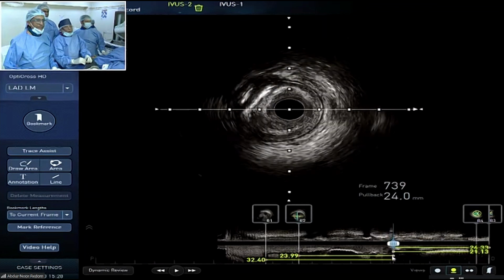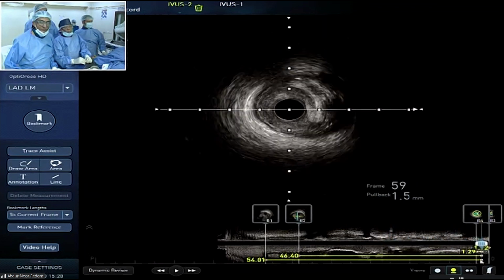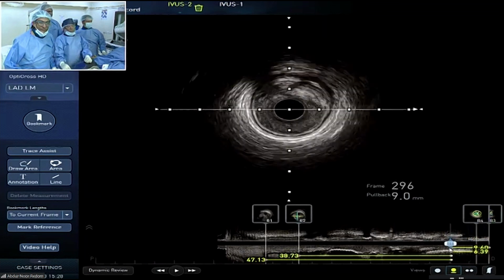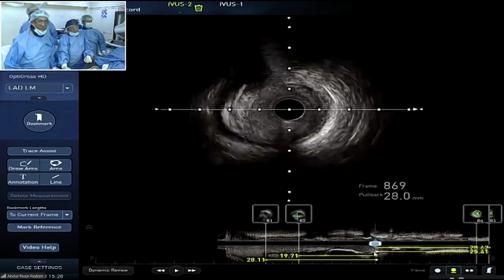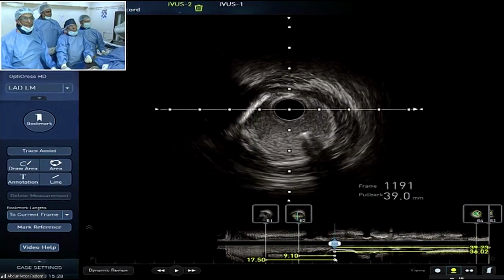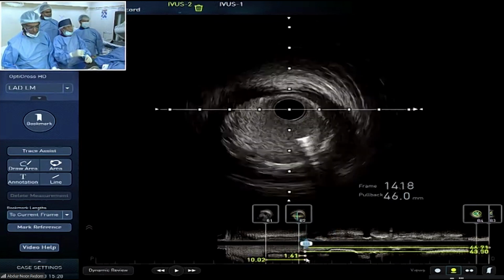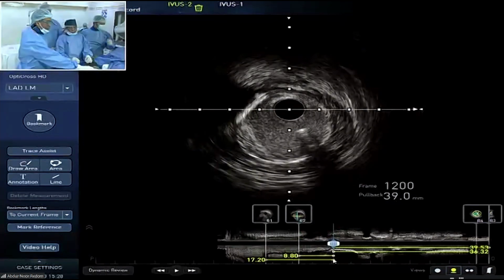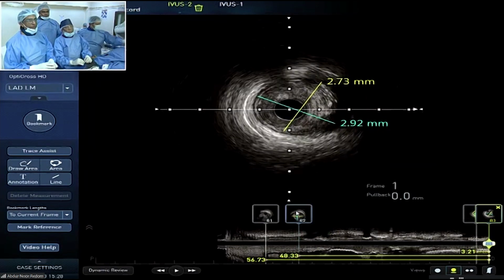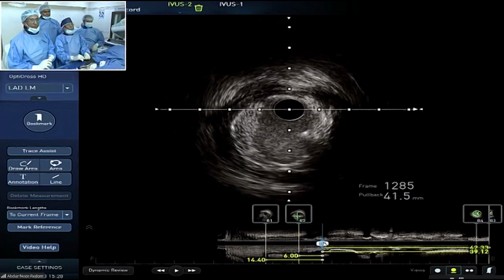But maybe with the IVUS, you see the artery was kind of elliptical. I think you overmeasure if you go by the IVUS. I think it's more 4.1 than 4.4. So probably it's 4.1, maybe close to 4. Yeah, I would do 4.0 with the NC and then probably do another IVUS to see if we need to do any further post-dilatations of the proximal branch.